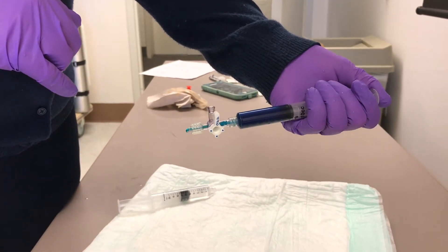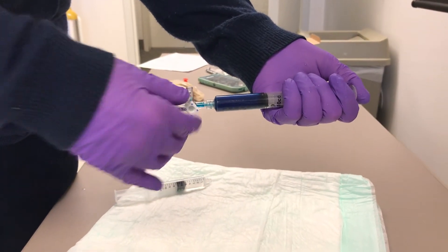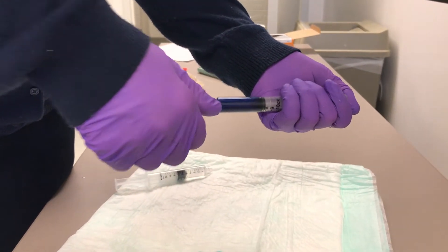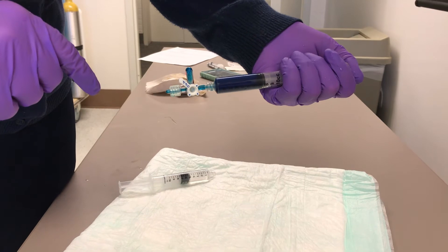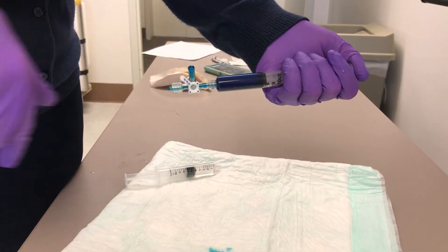We're priming all the way here, and now I'm going to turn it off to that side and prime this way. If you want to stop flow and decrease the chance of entraining air, put the stopcock about halfway — as you can see, I'm pushing and nothing is moving either way.